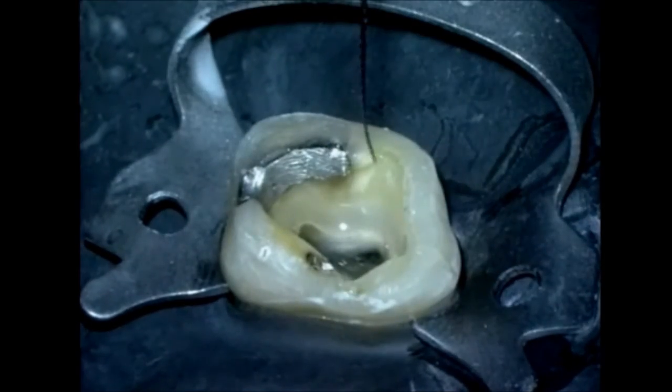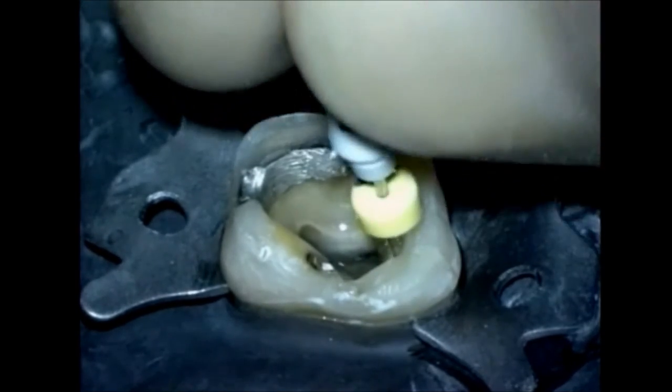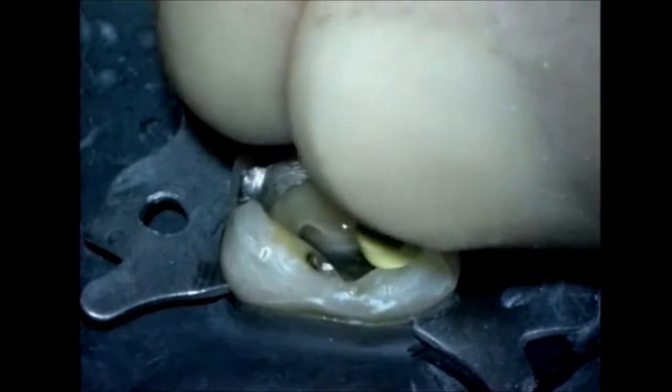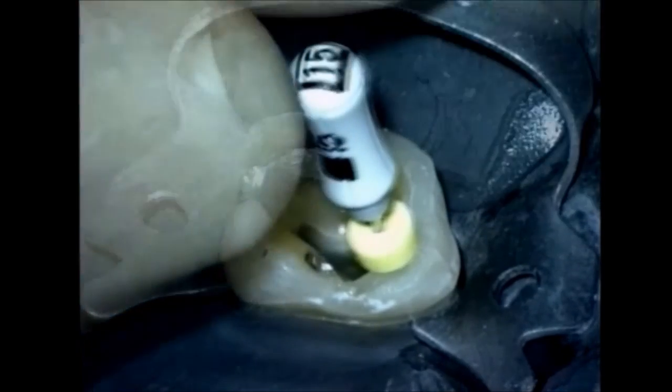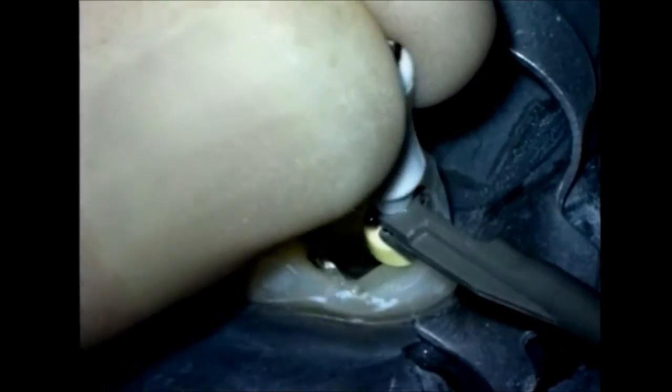At this stage of treatment, the 15 file will readily drop to length. When it's at length, it's wise to reconfirm working length, and I use the electronic apex locator. The lead lassos the shank of the file, and the reciprocating handle motion is gentle, and we just minutely move the file away from the terminus. Then the file is slid back to length. If we get a stable reading on the display unit of our electronic apex locator, we have confidence of working length and we can proceed on.